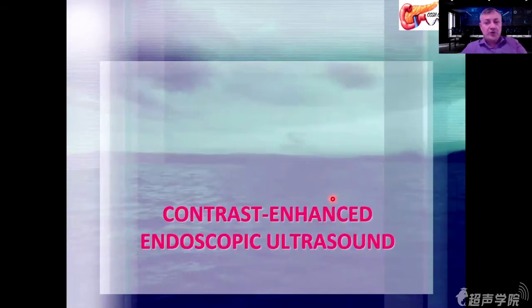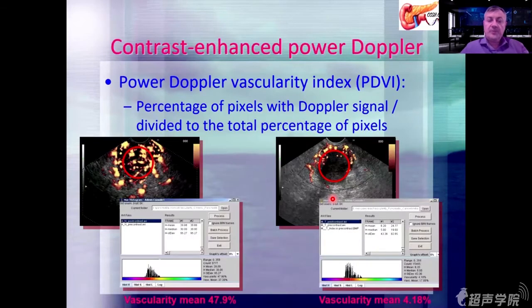Then when looking at contrast-enhanced endoscopic ultrasound, there are applications here as well. The advantage as compared to transabdominal is that the transducer is a small linear transducer, so the frequency is higher. So you get a better resolution, but a smaller penetration as compared with a transabdominal probe.